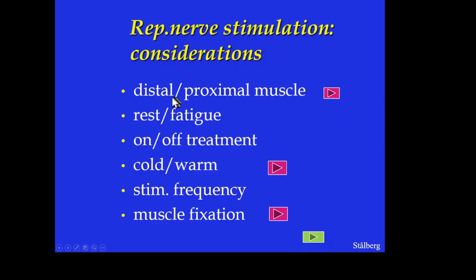Rest and fatigue: if the patient is exhausted when coming to the EMG chair after having climbed a lot of stairs, for example, then we get the diagnostic advantage of that, but it is difficult to compare exactly the outcome at different repeated examinations with each time the patient is coming in.